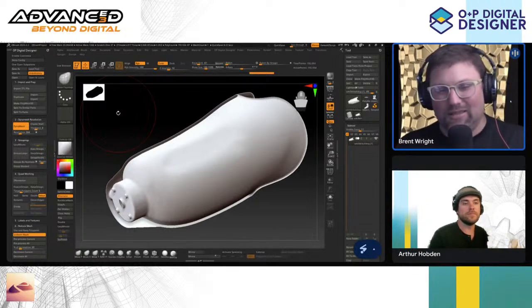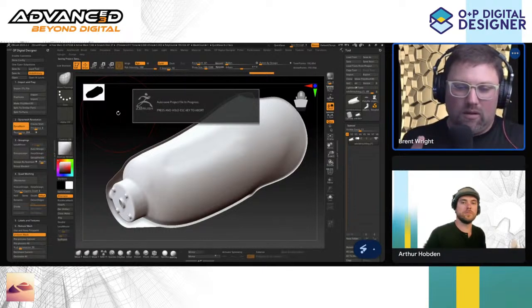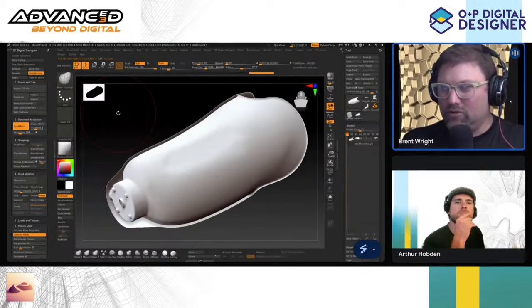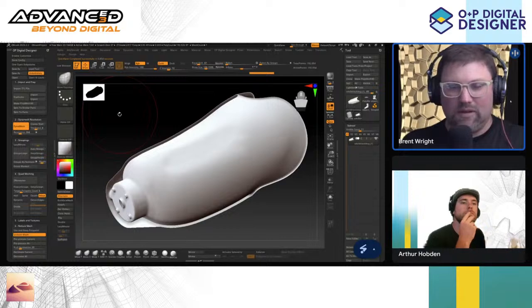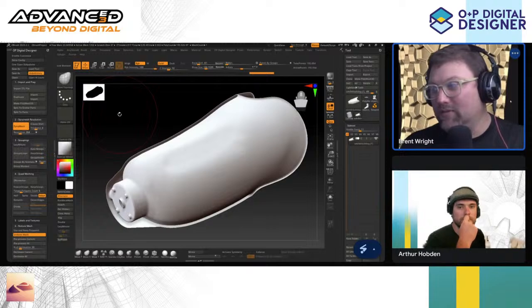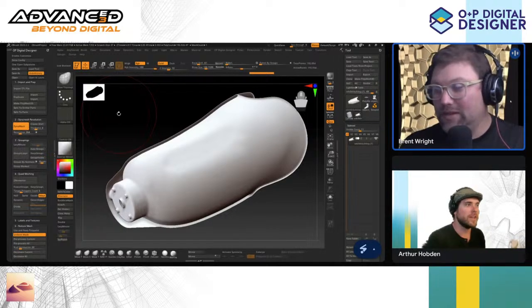And so I think that's where this comes into play. It gives them all the clinical control, like via Nomad Sculpt. They do all the things that they need to do, and then all they have to do is put it into this web app, and out comes a socket ready to print for their FDM test sockets.